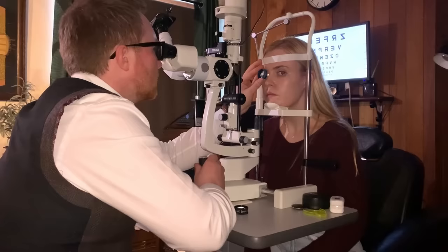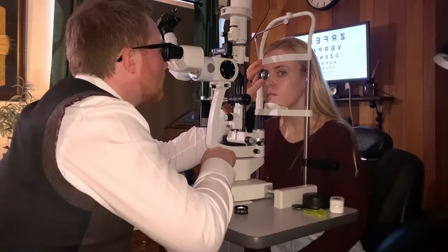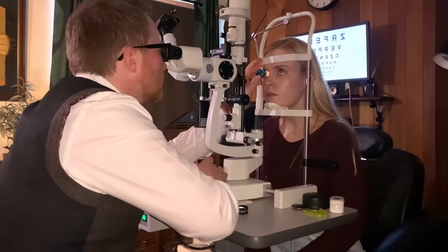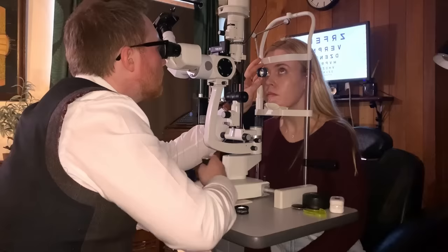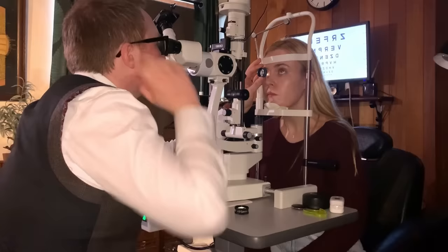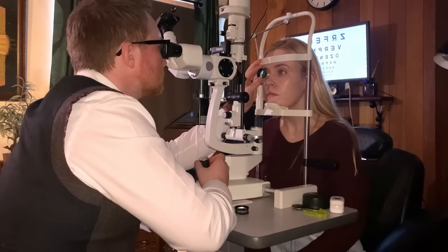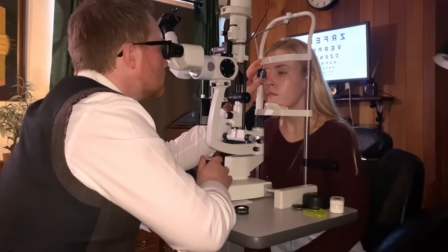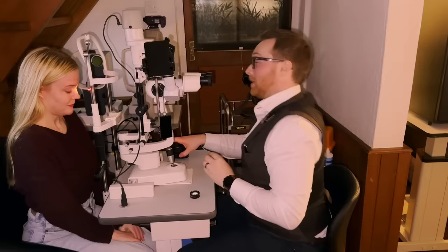Big wide stare for me, it's very good. And up and to your left. Past my ear, and it's just going to get bright for a moment. Well done. Excellent. There we go. That's one eye done. And then we'll do exactly the same for your other eye.